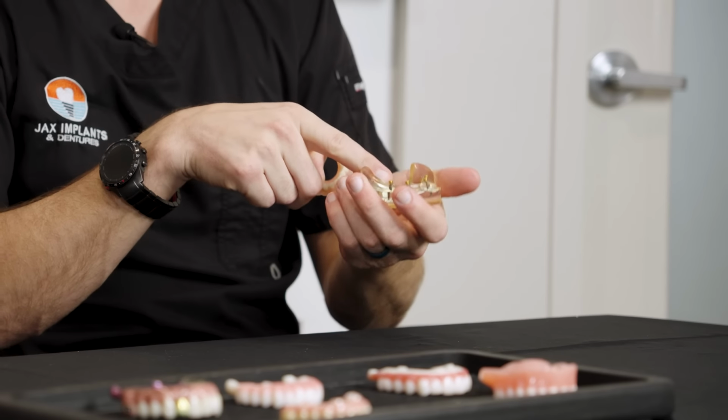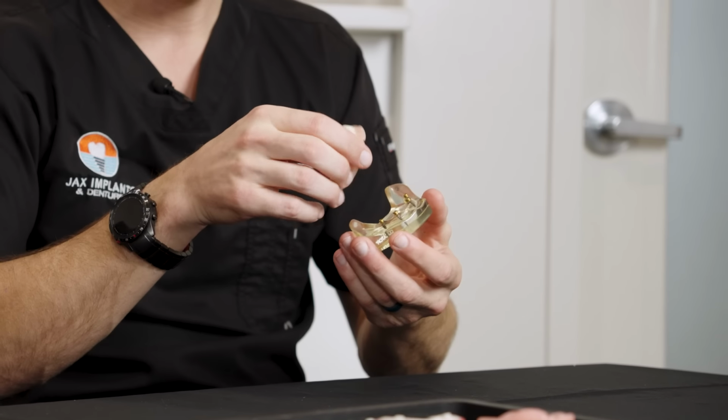With the caveat that this is probably similar to the long-term temporary, in that the healing period is pretty bad. With this, you can hook the implants on immediately, and you're like, well, wait, why can I hook the implants on immediately here, but I can't here? It's because here they're rigidly fixated. Like a suspension bridge, they use each other for support, whereas these are all out on their own. Each little snap is like a snap on your jacket or your jeans. They're each individual and not braced together, so you have to wait for them to integrate, like that running versus walking or the hip implant. At 3 months they're integrated, so we can snap them in at the 4 or 5 month mark once we've got the denture made.